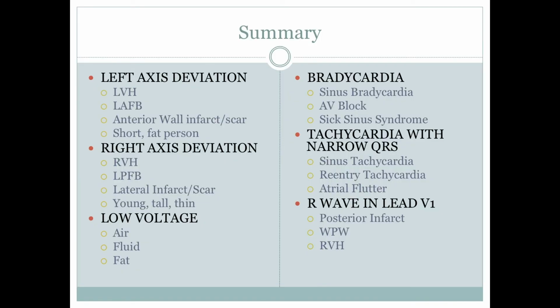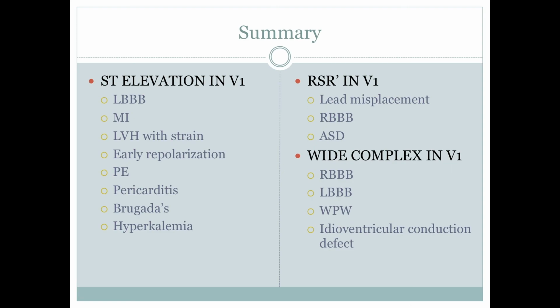So that's all I had. I know it was probably pretty quick and in-depth. If you have any questions, feel free to ask me, but I think this is a pretty good approach to looking at EKGs: knowing a handful of specific findings and then knowing a short differential to help lead you and guide you when you're looking at these EKGs.